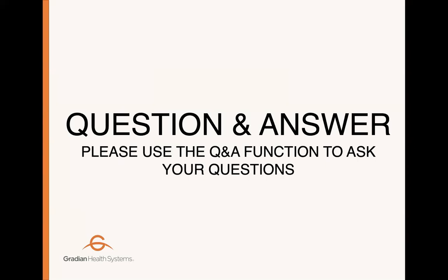Yeah, thank you so much, Dr. Luisa, for that additional comment. Indeed, humidification is very, very important. And you would see that most ventilators or even the external flow meters would have a provision for you to be able to humidify, for obvious reasons that our presenters have given. Wonderful question. The last question, I can't see any hands raised still.